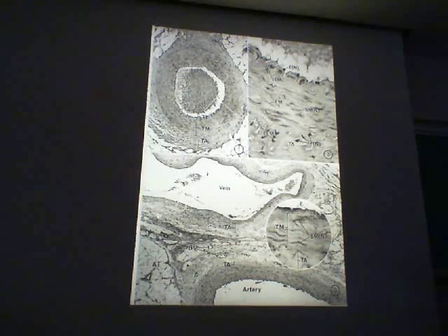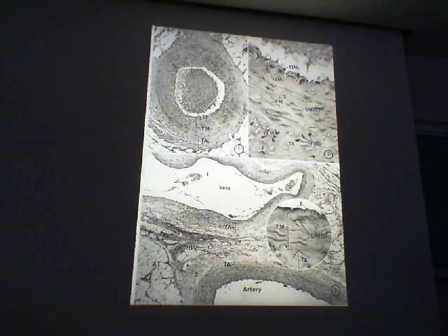Okay, well we've got another section right here, and right out here, what is that layer? External elastic lamina or membrane. Okay, let's go on to the next one. We have all three layers right there, and note that that tunica intima in these muscular arteries is going to be thinner than what you see in an elastic artery.